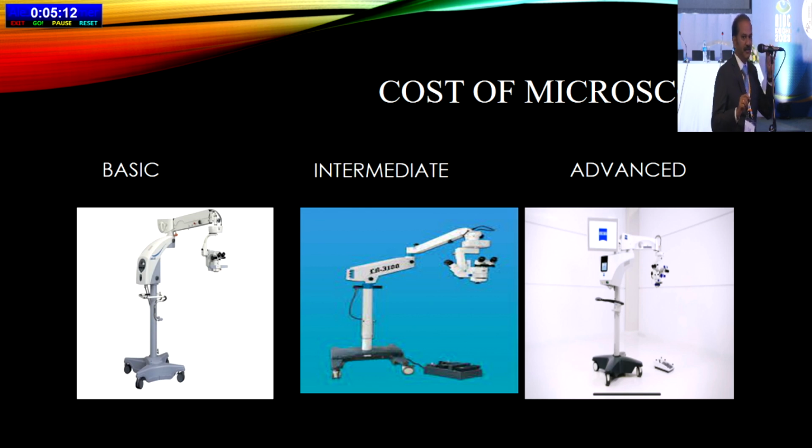See, I believe in something like what they call for the multifocals, the neural adaptation. You need to experience it in your OT at least for 2-3 sessions, and then go for a decision. You can talk to your friends about the financials, but the experience of operating comes only for you. Your friend could be an emmetrope. His experience will be completely different from when you have a refractive error.